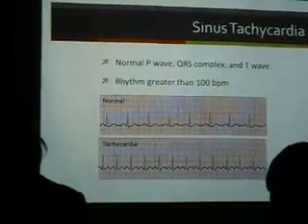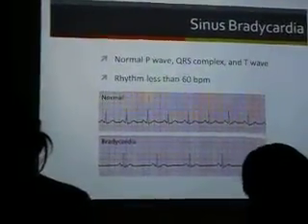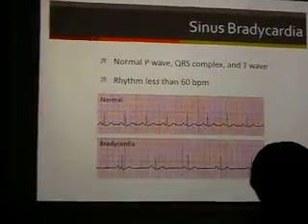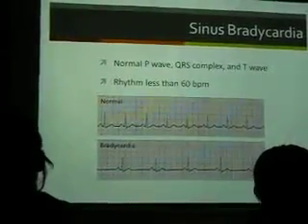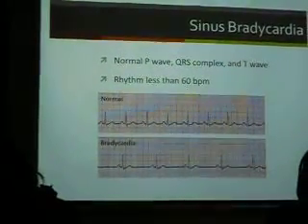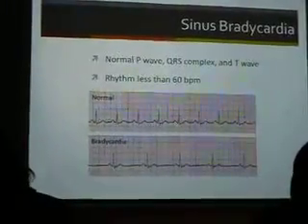All right, if your heart rate can go too fast, it also can go too slow. This is sinus bradycardia. So brady is going to be the slow heart rate. Normally it's less than 60 beats per minute. And again, if you don't have a heart rate that is fast enough, then the pumping of blood through the heart may not be adequate to feed your brain and your kidneys and your digestive system and all that kind of stuff. So again, if we counted the cycles in a minute, there'd be less than 60.